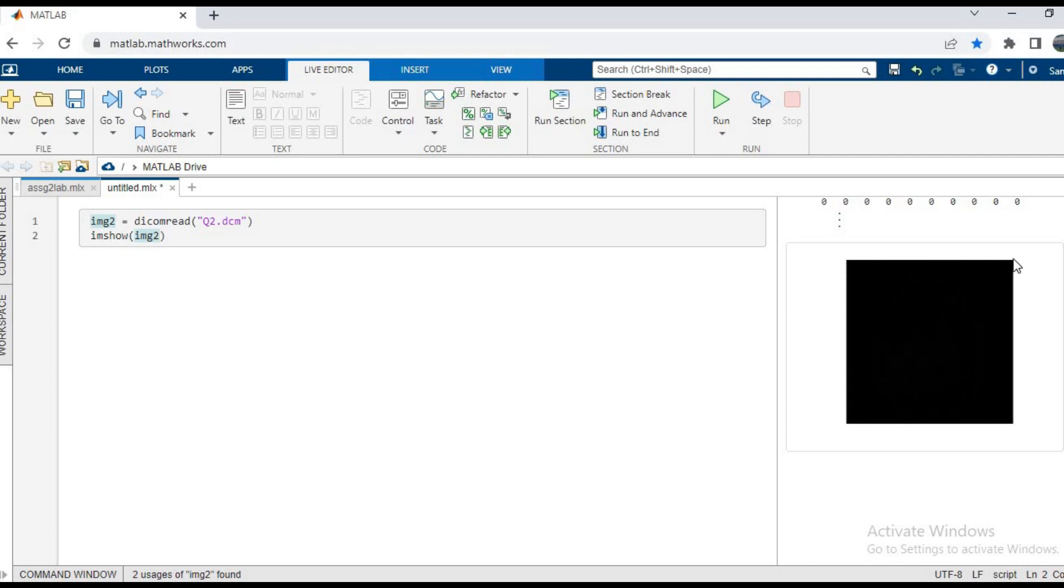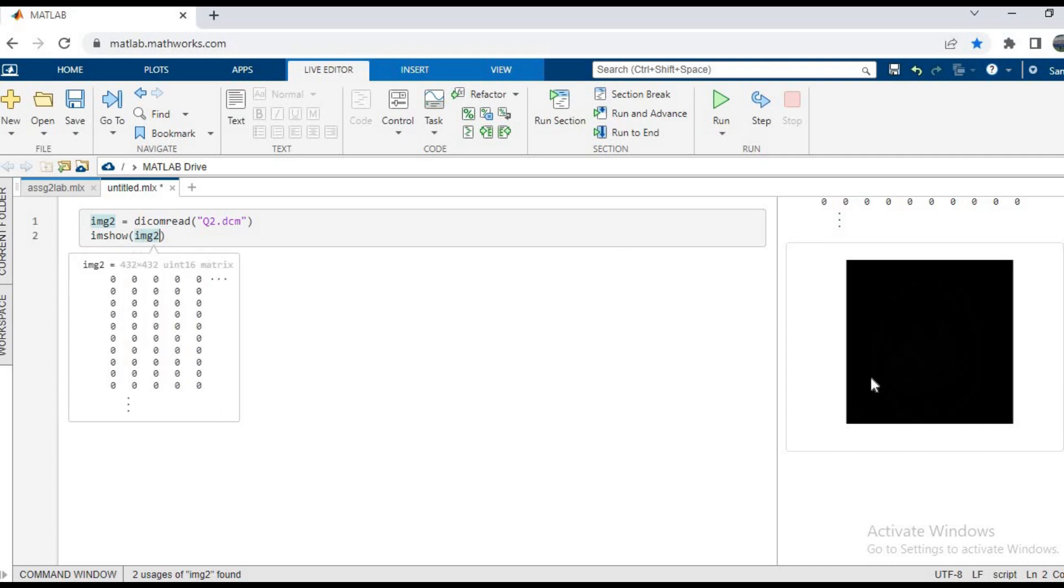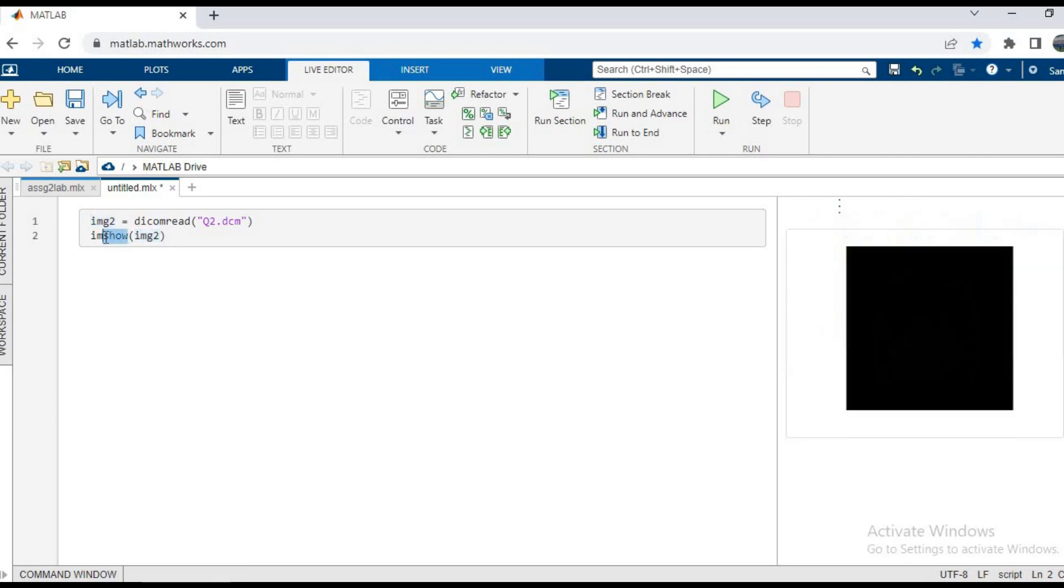So that is because DICOM images cannot be shown directly with the imshow function, and that is why we need a different function, and that is called imagesc. As you can see, the matrix has been loaded but the image cannot be seen, so I'll change the function.